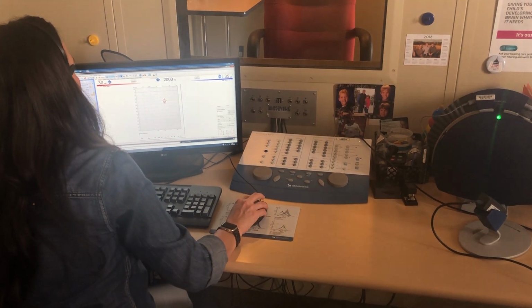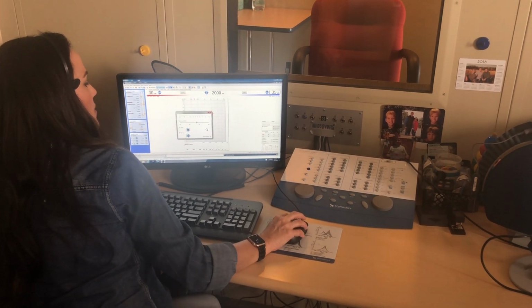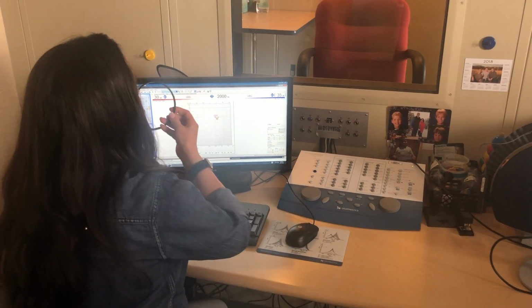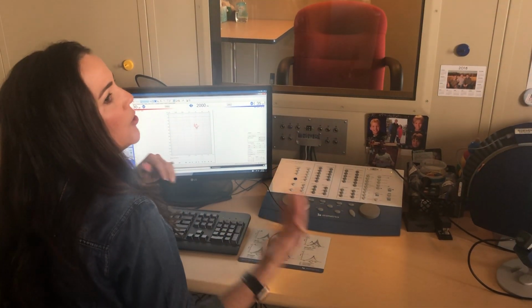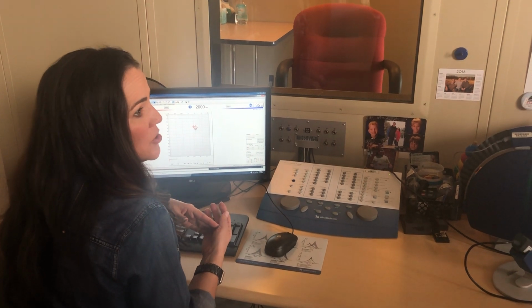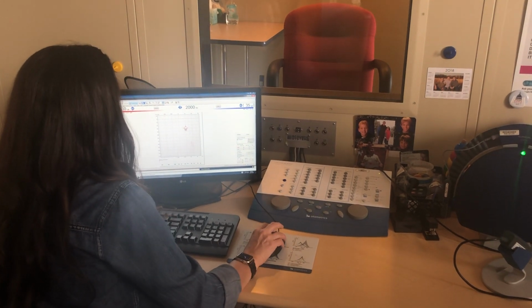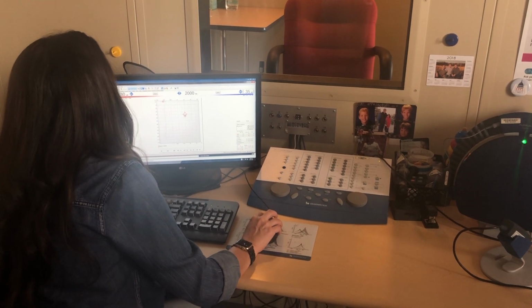If you wanted to do that here, talk forward is this green button, this speech balloon right here, and now my voice goes to the patient so that I can provide instructions. I want you to remember you need to instruct your patient prior to putting the insert earphones in. And even though you all know what you're doing, you're going to instruct your patients just for practice, because you're always going to feel silly at first saying it until you get fluid instructions to use.